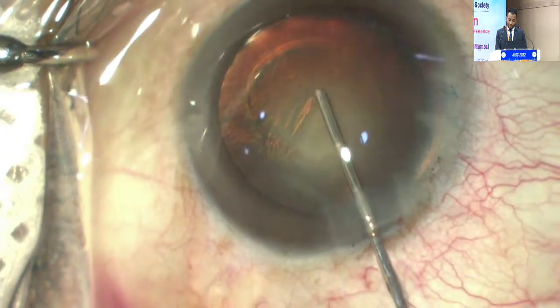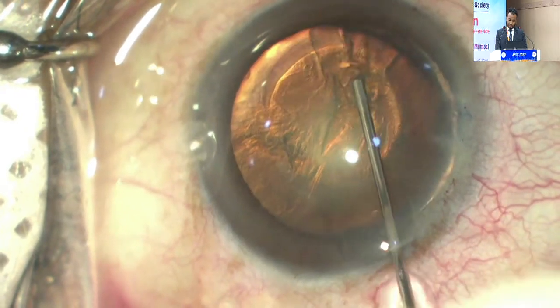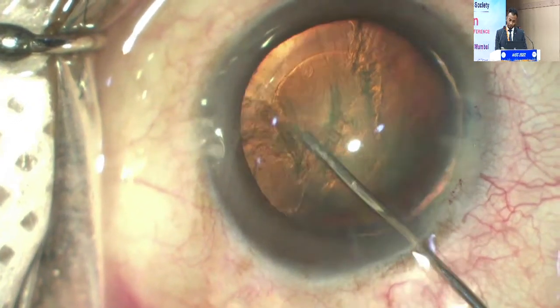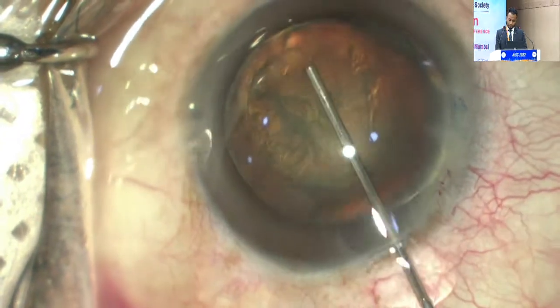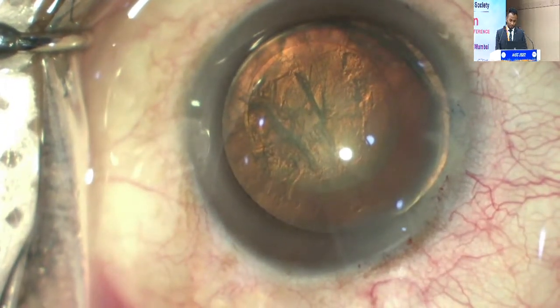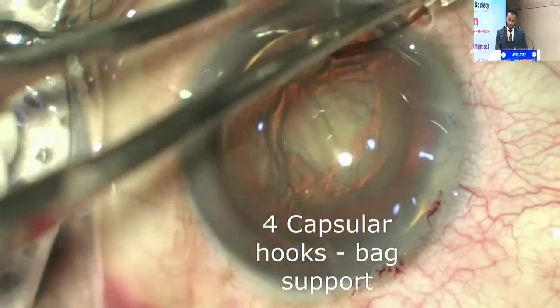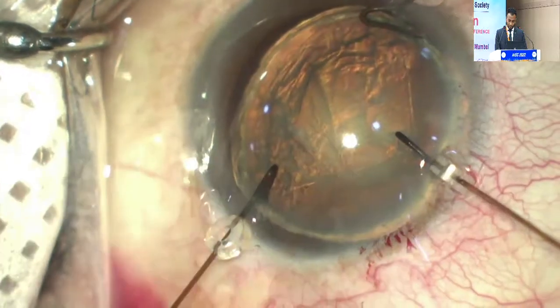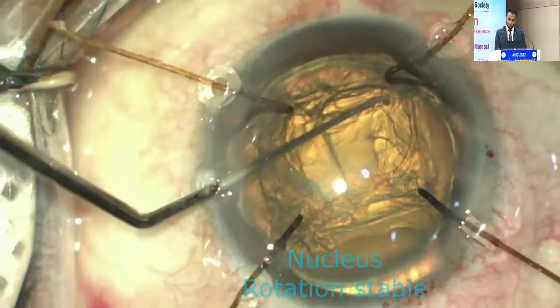Since this was a large 4 to 5 clock hours zonular dialysis, after this, just a small bolus of injection. I've decided to fix the bag first with 4 capsular hooks.